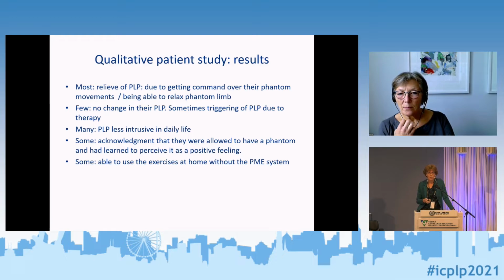Many of the patients told that the PLP was less intrusive in daily life, which is very important. And some acknowledged that they were allowed to have a phantom, and they had learned to perceive it as a positive feeling. That was really important for the patients, because it had always been negative, and now they learned that it could also be seen as a positive thing, and that also gave relaxation. And some were able to use the exercises at home without applying the PME system.